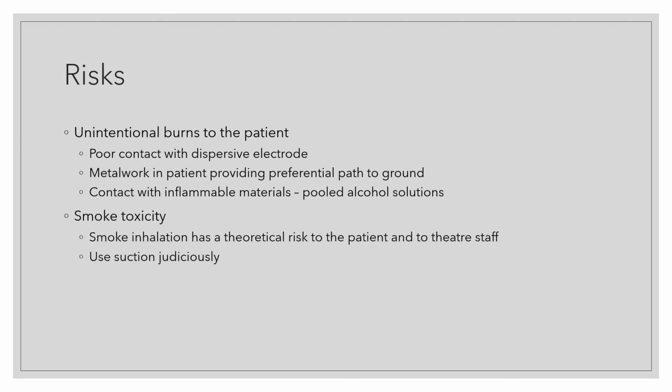And finally, smoke toxicity, a little bit hard to quantify, not too much evidence. But actually, if you think about it logically, I suppose, as a surgeon, if you're there breathing in vaporized patient smoke, there probably aren't too many benefits to that. And actually, there probably are some risks to inhaling smoke constantly while you're operating. So for any SHOs or assistants, I would advise you to use suction judiciously to try and remove the worst of the smoke before it gets to your lungs.